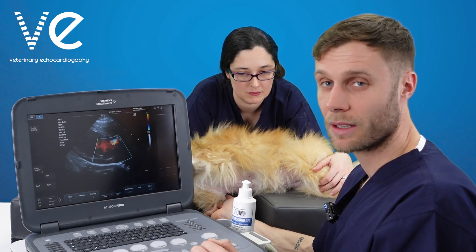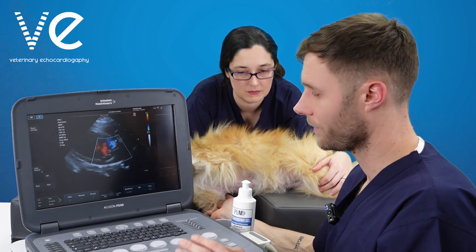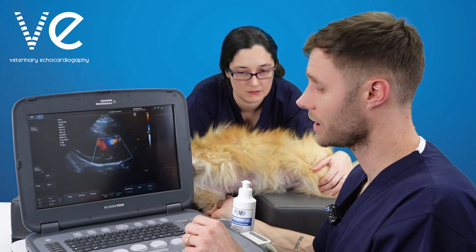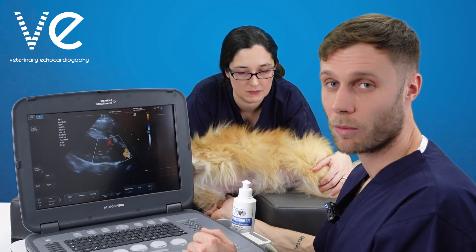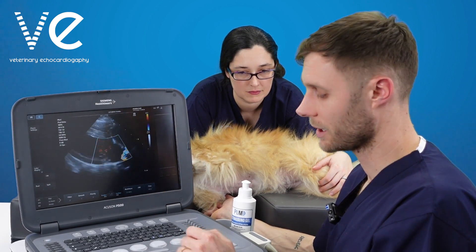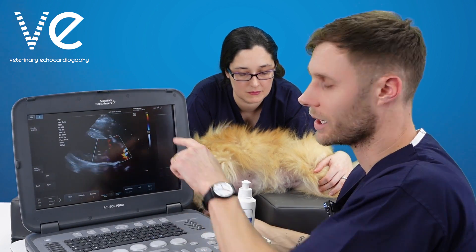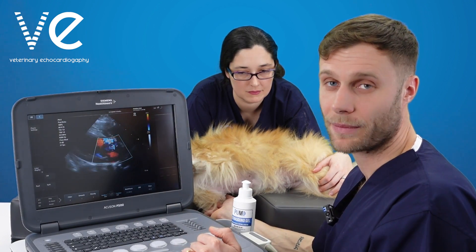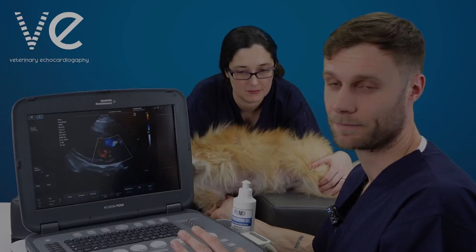So the four options for optimising your colour Doppler: first, make sure you've got a nice 2D image. Second, optimise the size of your box — as small as possible while still covering the area of interest. Third, make sure your gain is optimised. And fourth, check your colour scale. Those are our four basic tips for optimising colour Doppler.